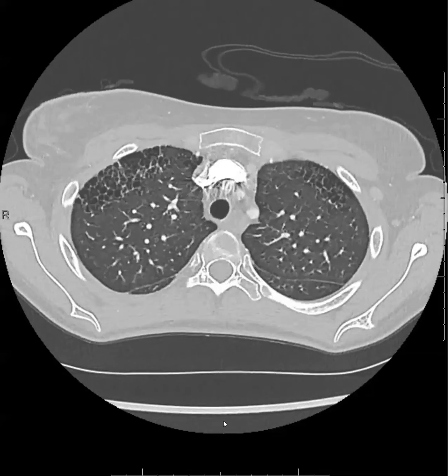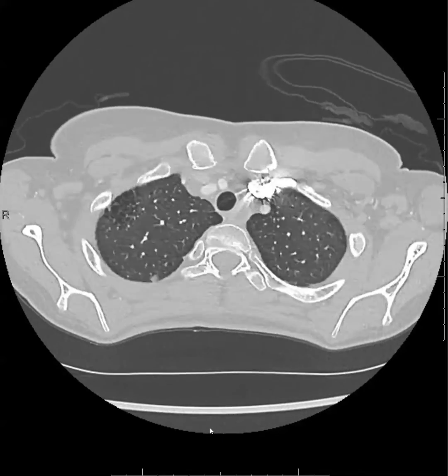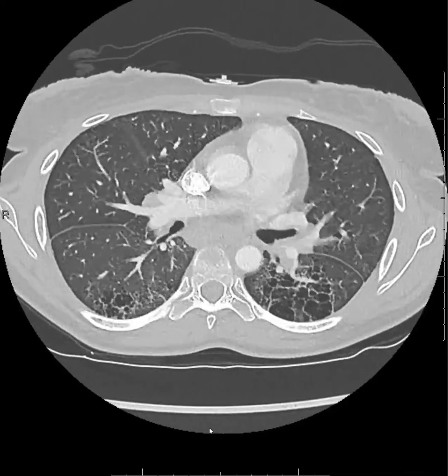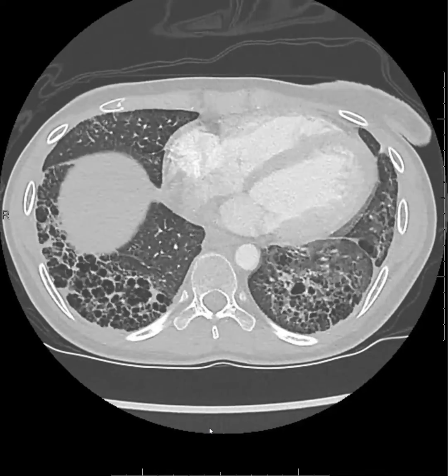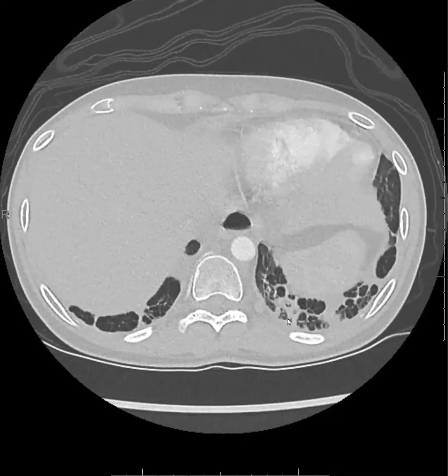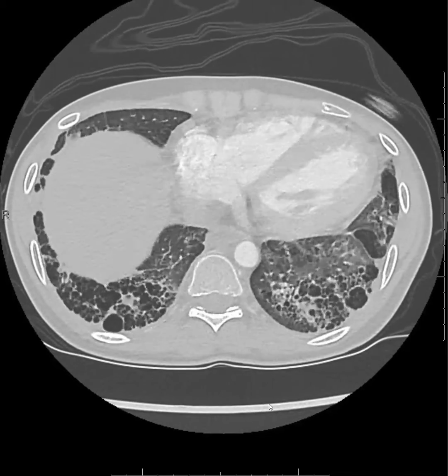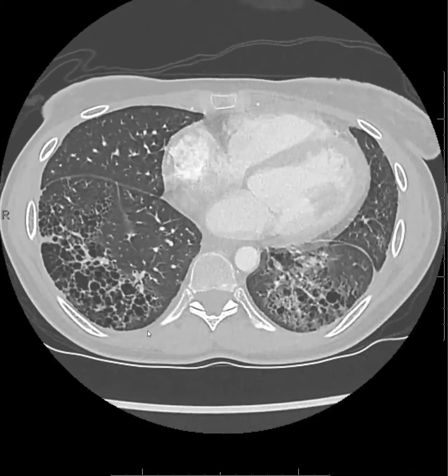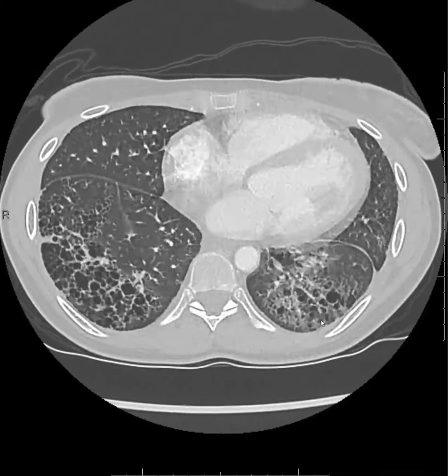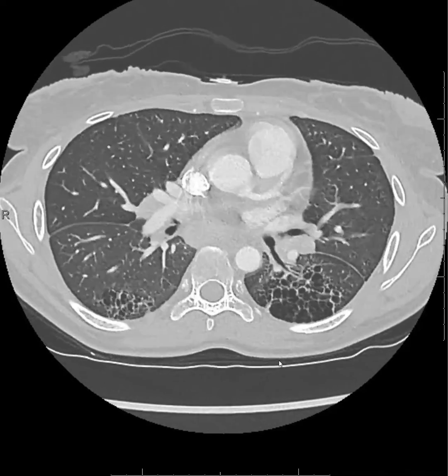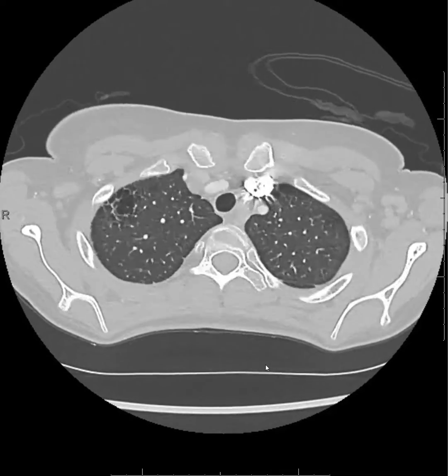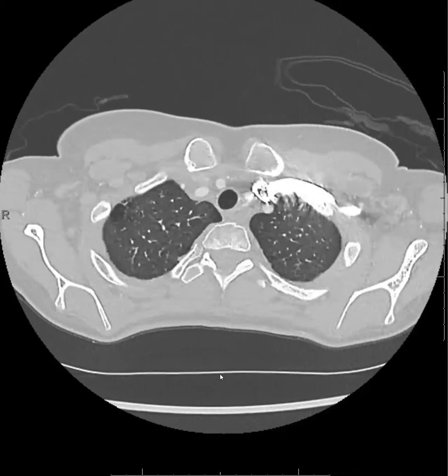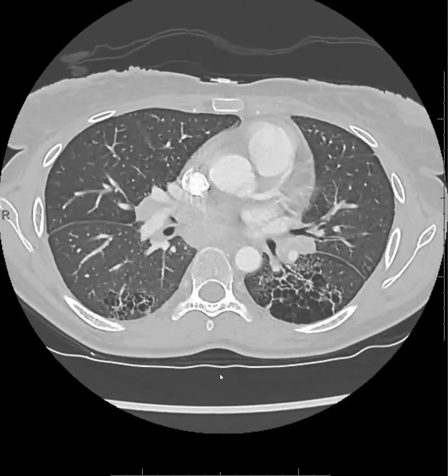Here's another case of pulmonary fibrosis. On the surface, if you are trying to categorize this using the Fleischner or multi-society guidelines, you would call this UIP. There's a little bit of consolidation here, but let's assume that's inflammatory. It's basal predominant and peripheral predominant in most areas, so we're going to call this a UIP pattern.